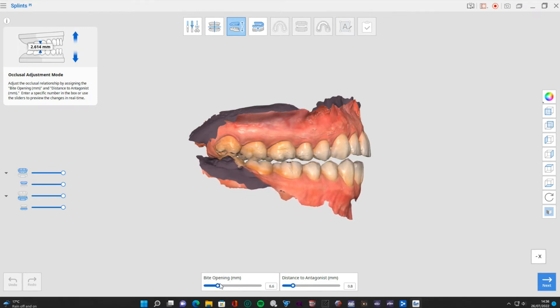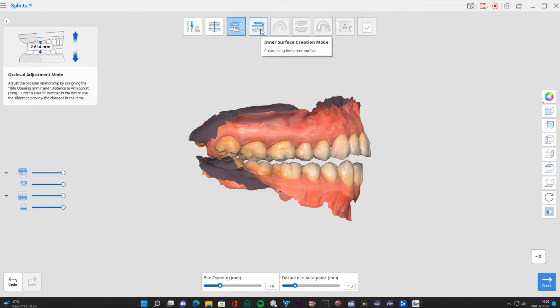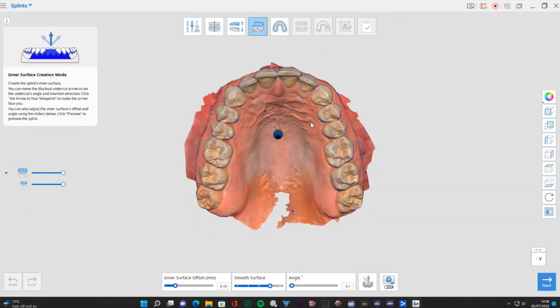We can open things up to choose how big this distance we want to be. I'm going to put in about 1mm here - you can see it's telling you how much you want. You can type these settings in or adjust them with the slider. Moving to the next stage, this is the inner surface creation mode.